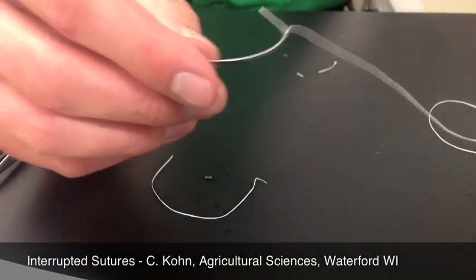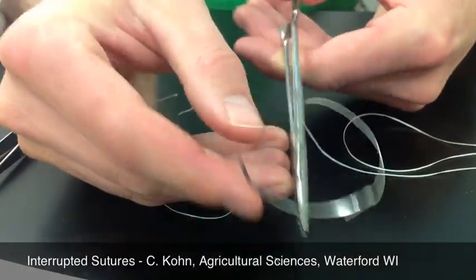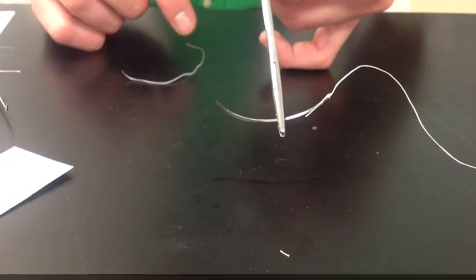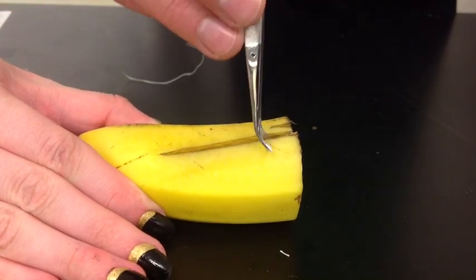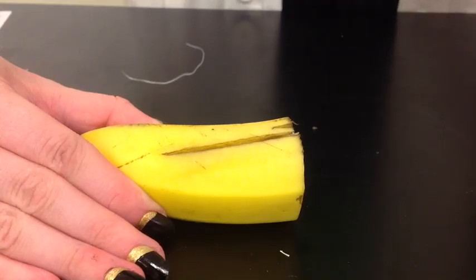I'm going to take my needle holder and I'm going to grasp it about a half to two-thirds of the way, like so. Yours should look like this before you get started. What I'm going to do is lift up my skin with my forceps. You can do it one of two ways — you can either pry it up this way or lift it up this way. Either is fine. Just make sure you do it gently.